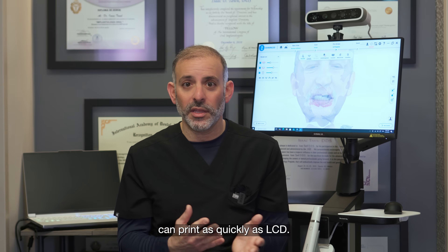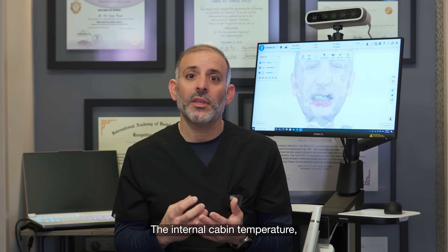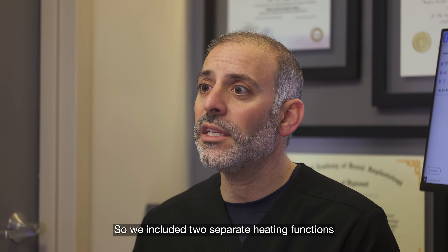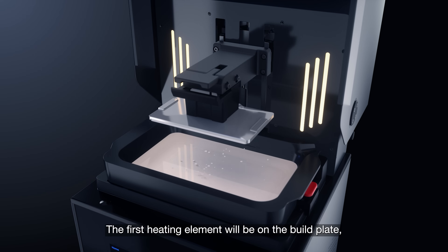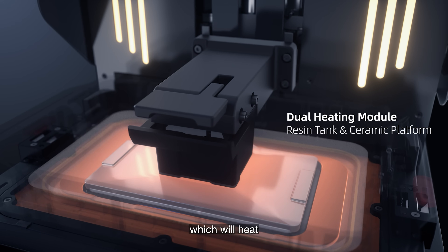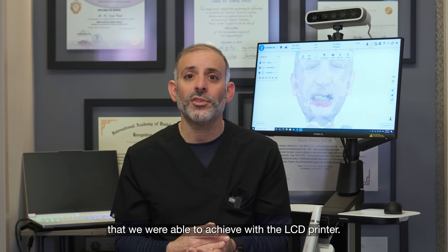We want a DLP printer that can print as quickly as LCD. The key to that was the light source, but also the cabin temperature. The internal cabin temperature, which was so successful with the AcuFab Cell, had to also be successful in the F1 printer. So we included two separate heating functions within the cabin: the first heating element on the build plate, keeping it at a consistent temperature ready to print; the second in the reservoir coming from underneath, heating the resin to be ready to print.